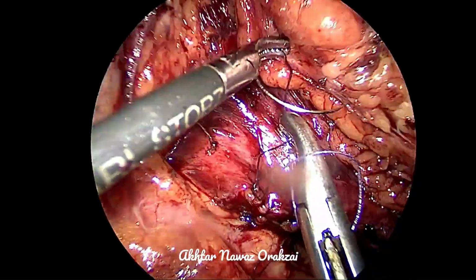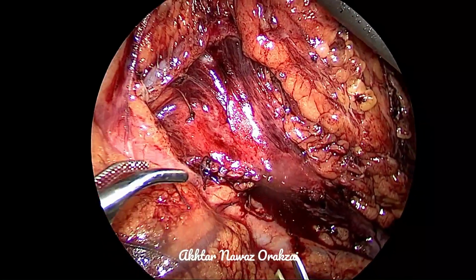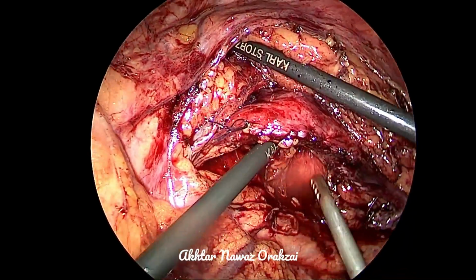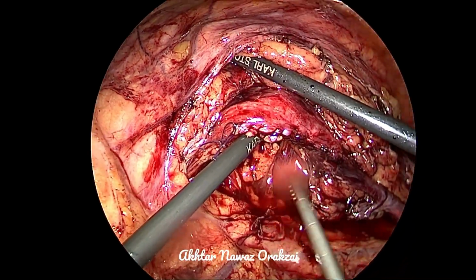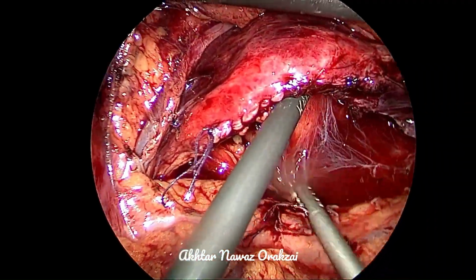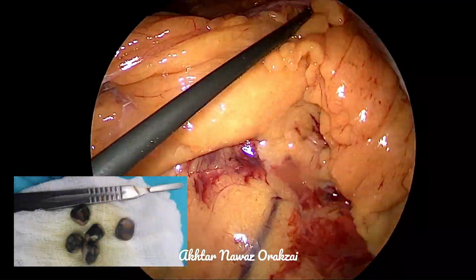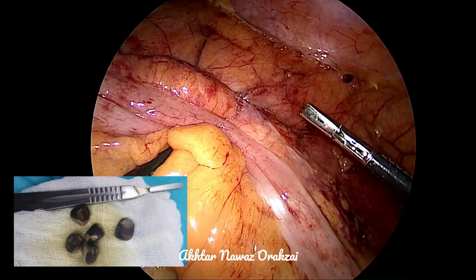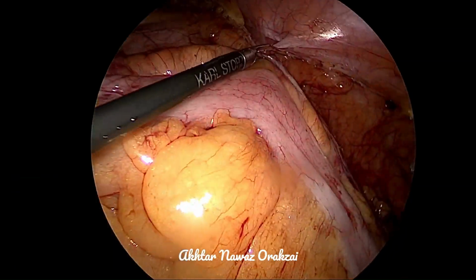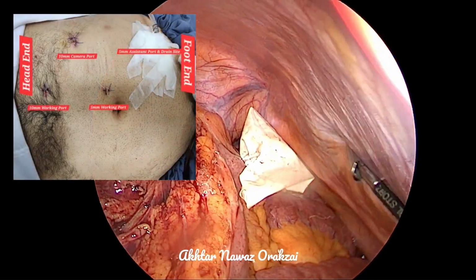I don't want to increase the size of the wound. So we cut the suture, we remove the needle, and we do the wash posterior to the kidney, anterior to the kidney, over the anastomosis. You can see the anastomosis is quite beautifully placed. It is without any tension. If you want, one can re-establish the location of the descending colon by clipping these two peritoneum. However, we decided not to.